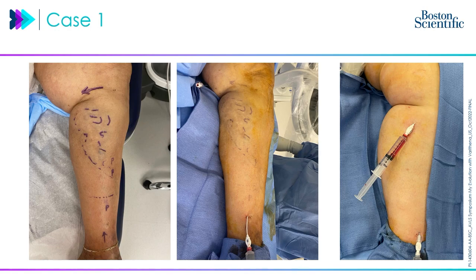I only included the one on the right to show that sometimes, in her case I didn't, because her GSV at the thigh was closed. But in most patients, if I'm planning to treat the GSV proximally, I may from the get-go get two access sites, because once I'm elevated, if the one distal access is enough for everything, then I literally just pull it out. But once you have just one access, your leg is up, you've started, and for whatever reason the foam is not making it up to where you definitely want to make sure the proximal GSV gets enough foam, you're in a harder situation.